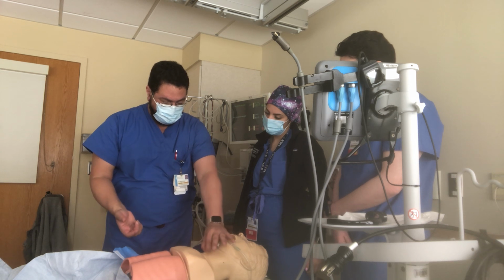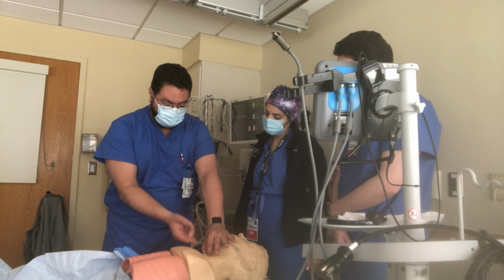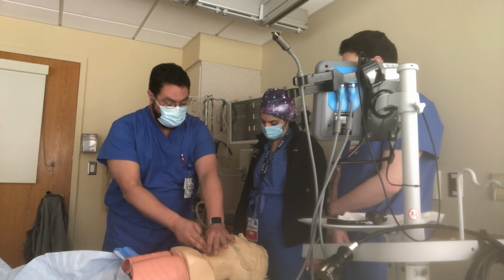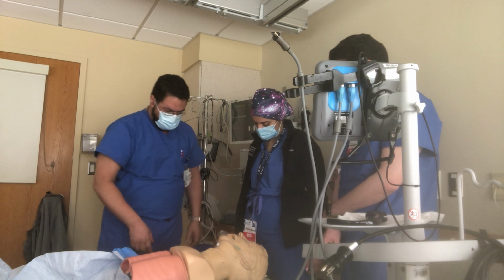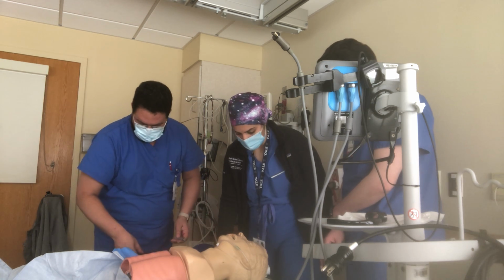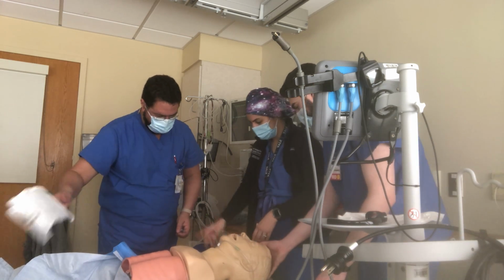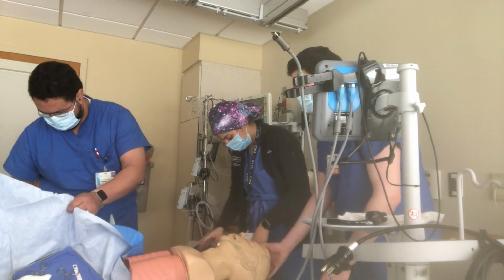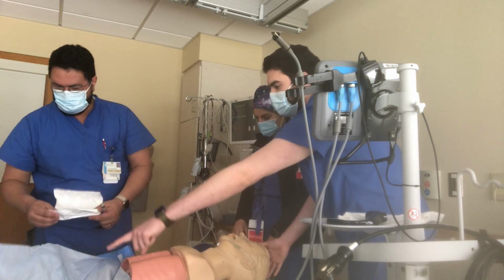So the key here is death grip, dimple, cut in between your fingers, and quickly put it in the tracheal tube. That is the open cric situation. For needle cric, what are we gonna do? We're gonna prepare stuff. So where is the needle? It was here. There's... right there.